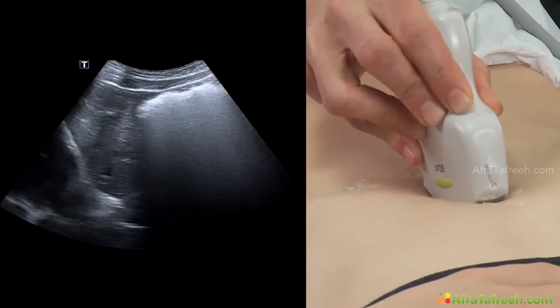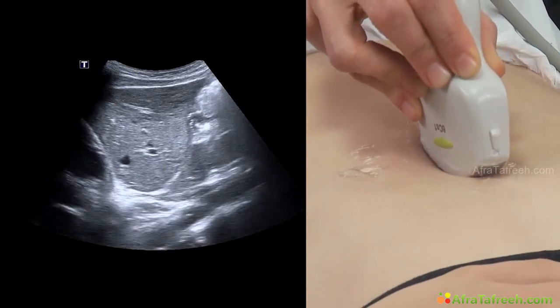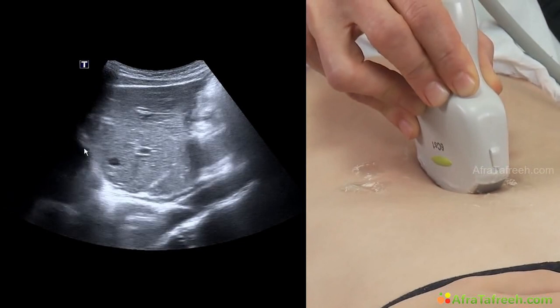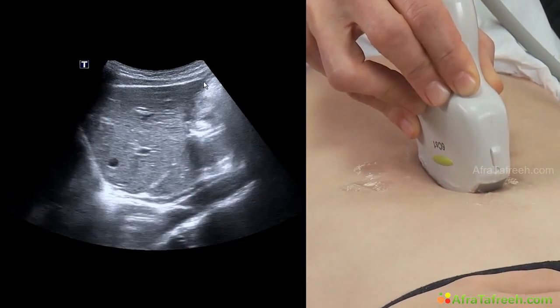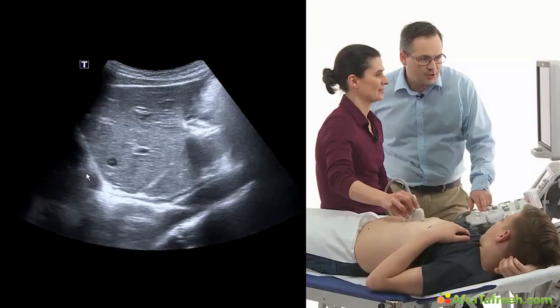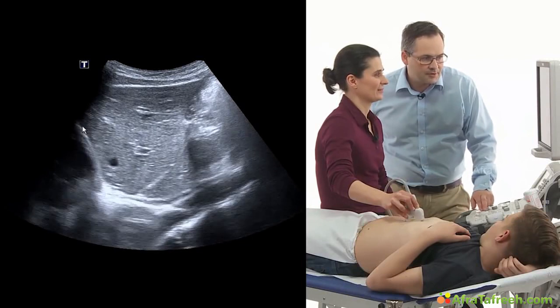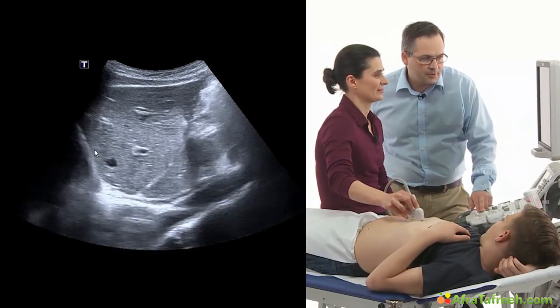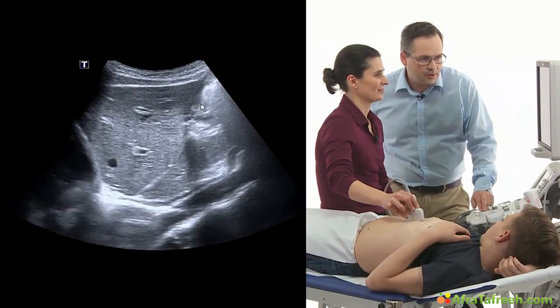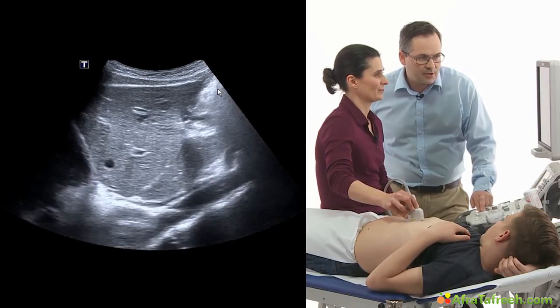And I ask my patient to inhale and hold his breath. And so, Christian? Fine. We see the left liver lobe. Very beautiful over here. On this side there's something moving. It's the patient's heart. So the cranial portion of this screen we see the diaphragm over here, left liver lobe, and the caudal border in contact with the gas-filled stomach over here.